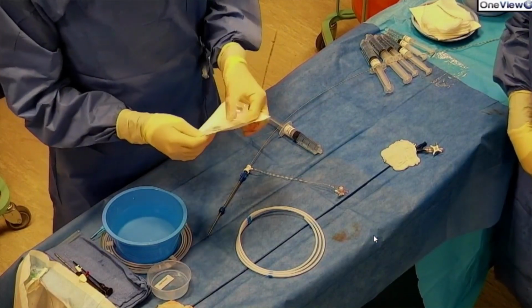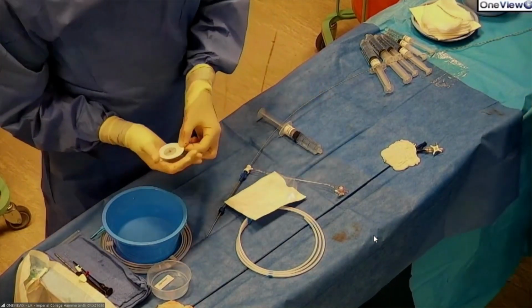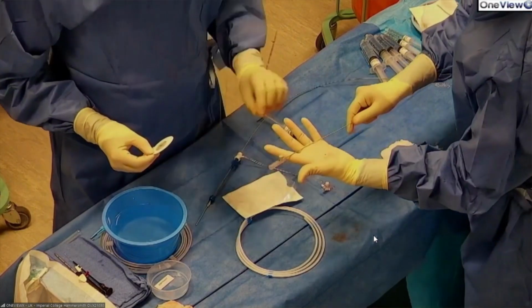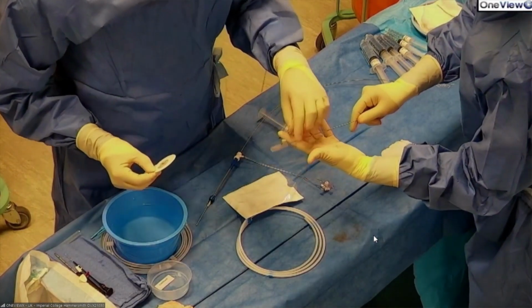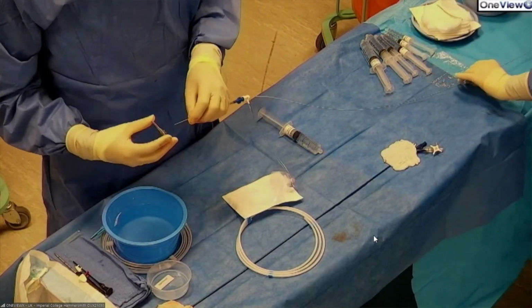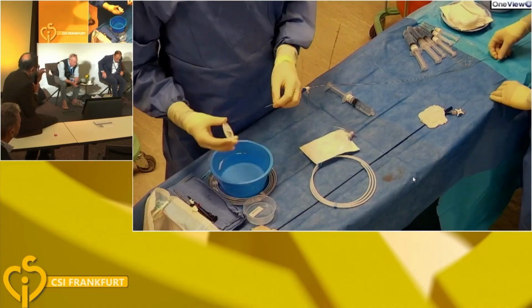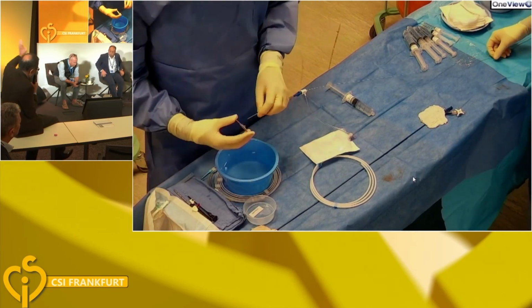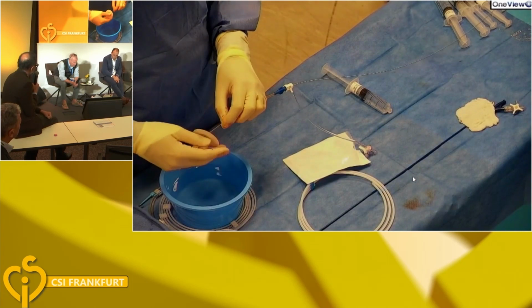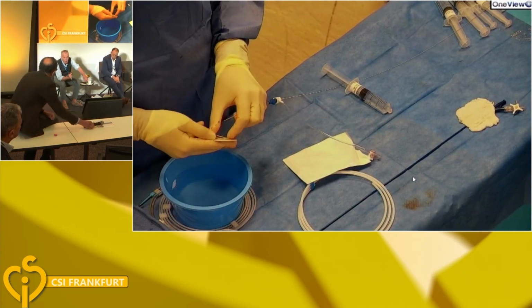Neil, have you got the slim cable or the fat cable? It has two different cables. Yeah, there's a 5 French, and I've been given a floppy one. I like the floppy one because it takes the conformability a bit more. The stiff one is a bit like the very old Amplatzer cable, where it takes its own shape until you release it.